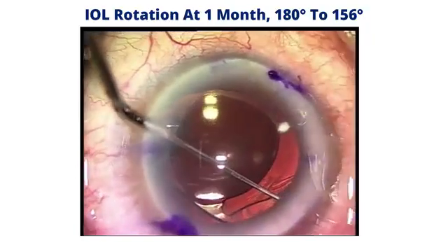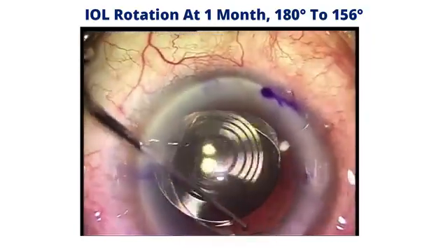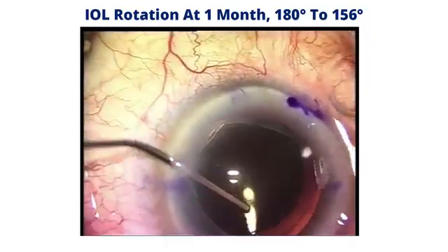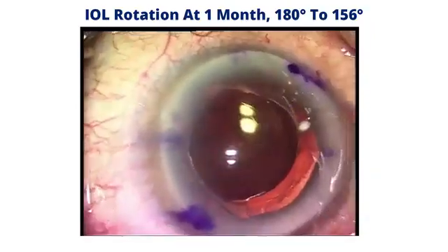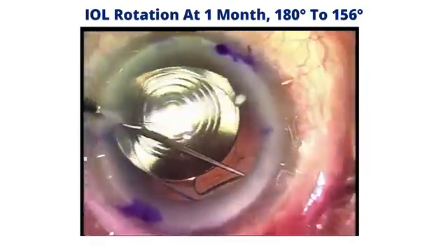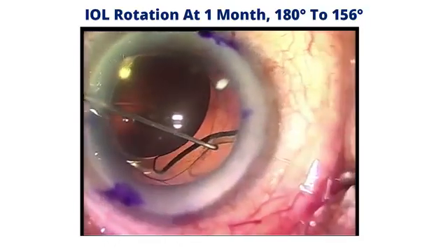So I'm doing the same for the other haptic coming in from a diametrically opposite position, and again I'm doing the same. And you see the striae now on the posterior capsule, and I'm having some difficulty. Okay, so I do not persist. I'm going to inject some more dispersive viscoelastic here to create that space, to open up the space between the anterior posterior leaf, and I'm trying again to release this haptic well.